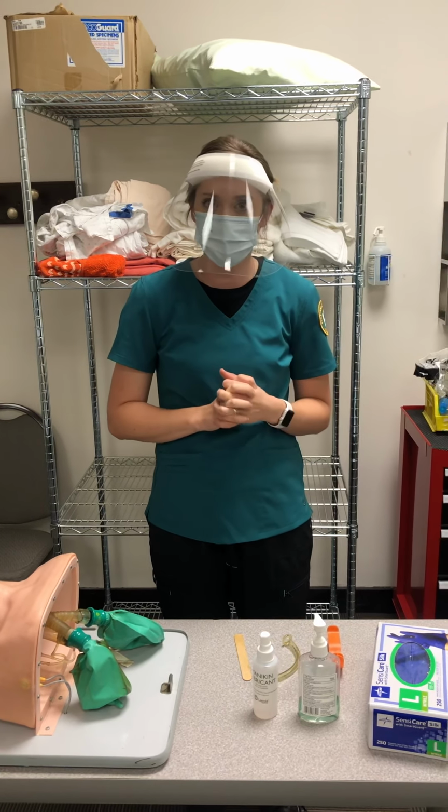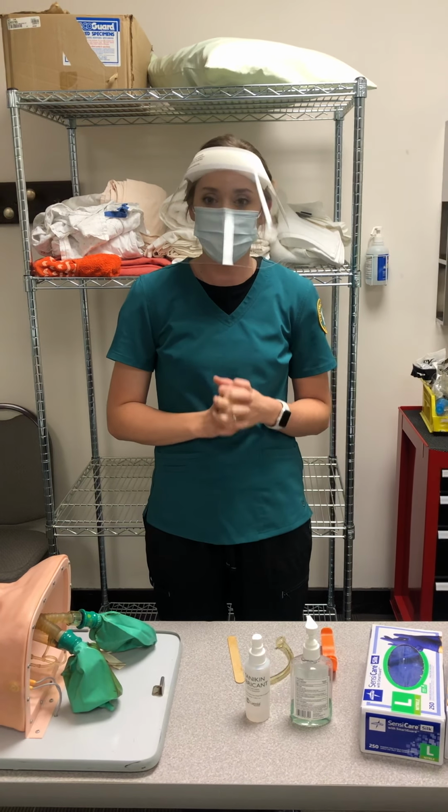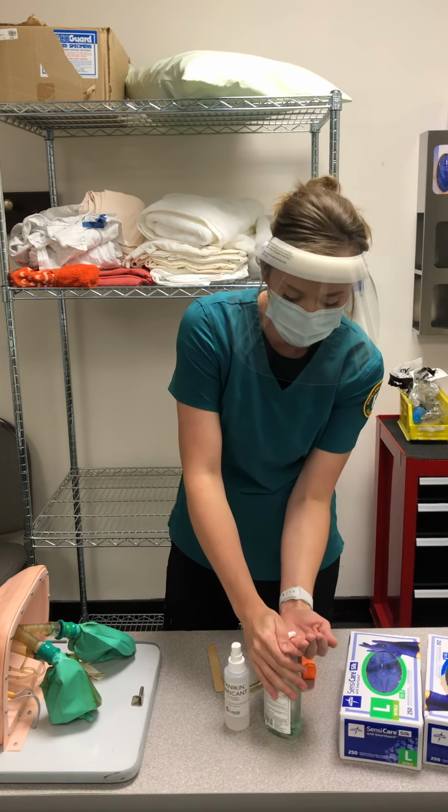I'm going to start with the oropharyngeal airway. The first thing I'm going to do is review the patient's chart and verify the doctor's orders. I will then gather my equipment. When going into the room, I will perform hand hygiene.